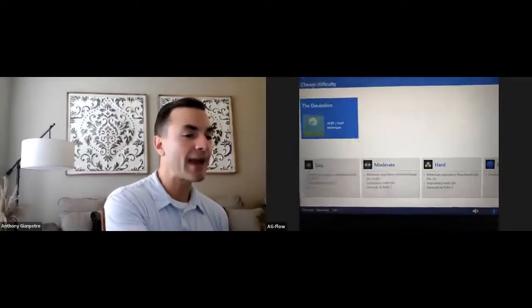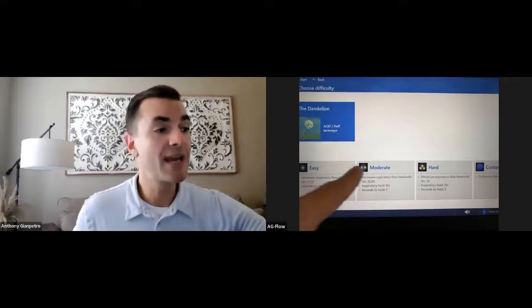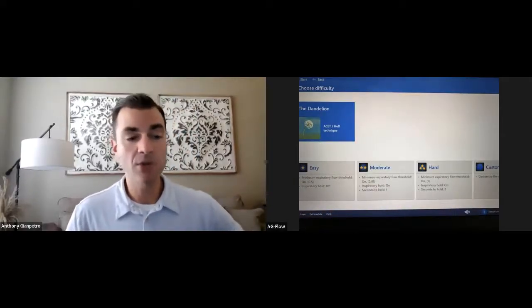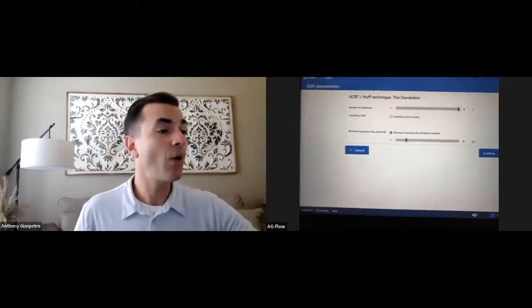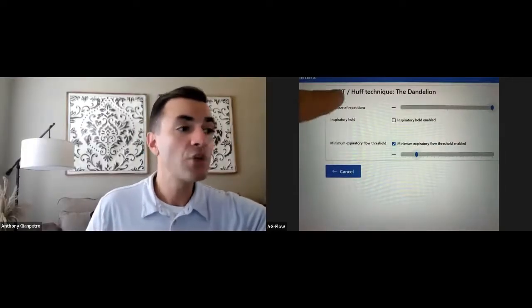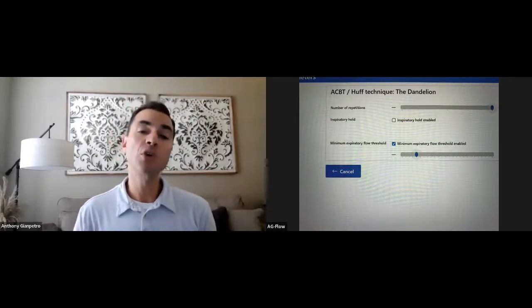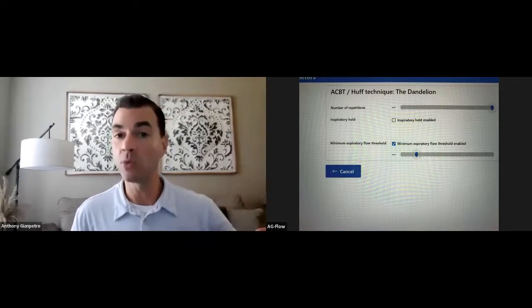Let me take a look, back this up for you a little bit. And again, your presets are all set there for you. They might not make the most sense to you right now. So let me take you to the customized parameters first. And notice there's not a whole lot to choose from here. Okay, it's a pretty simple activity. You'll see what I mean, but you can change the reps. And you can decide if you want there to be an inspiratory hold or not. So I will show you what that means. I always recommend to not start with that first, but to definitely work your way into including it.